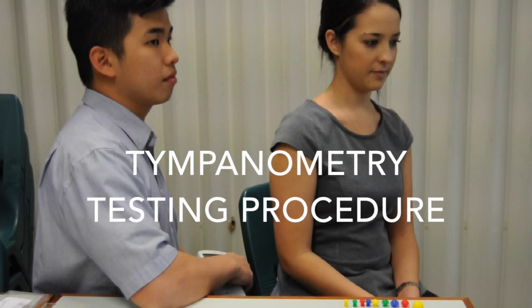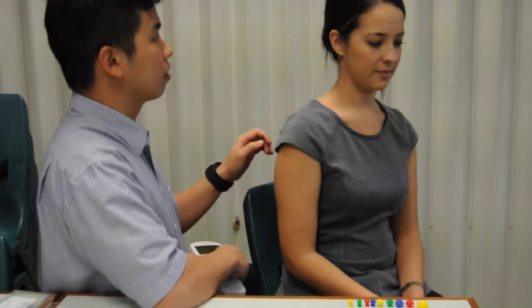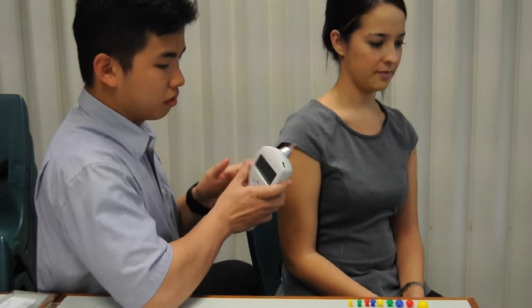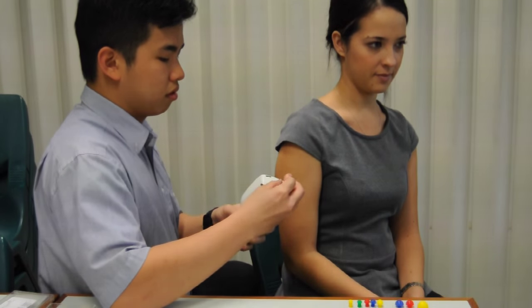The testing procedure is as follows. The clinician has previously washed their hands, introduced themselves, and obtained consent to conduct testing from the client. They select a clean tympanometry tip of an appropriate size for the client in order to establish a good seal.